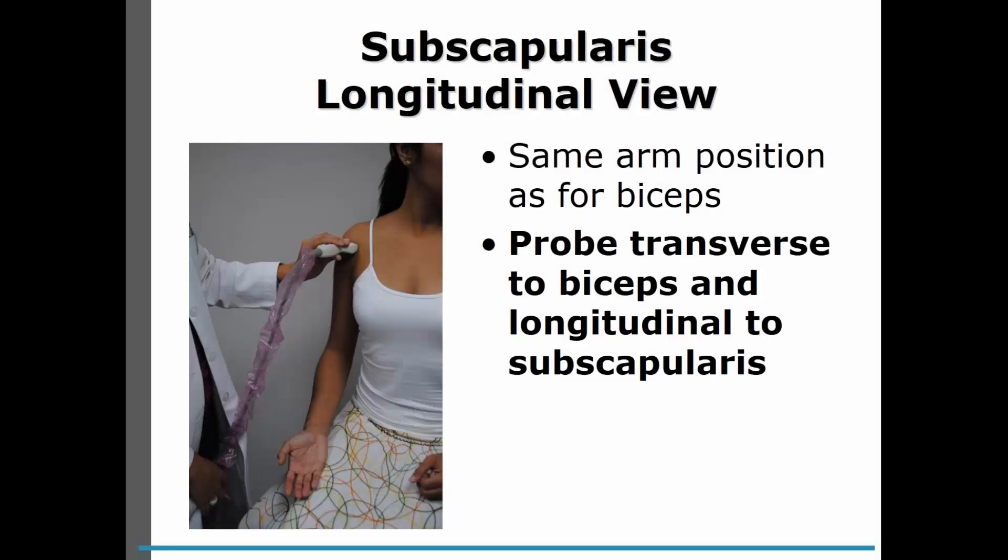Now we're going to look at the subscapularis in longitudinal view. We have the same arm position as for the biceps. The probe will now be transverse to the biceps and longitudinal to the subscapularis. As you can tell, we're holding the probe in a horizontal position here.